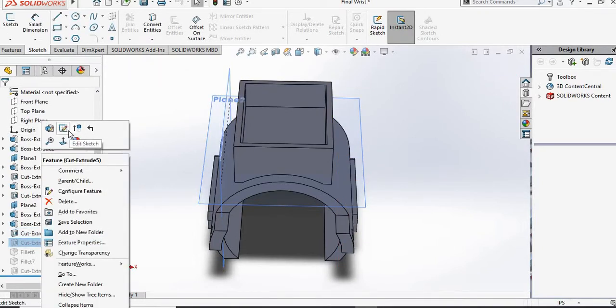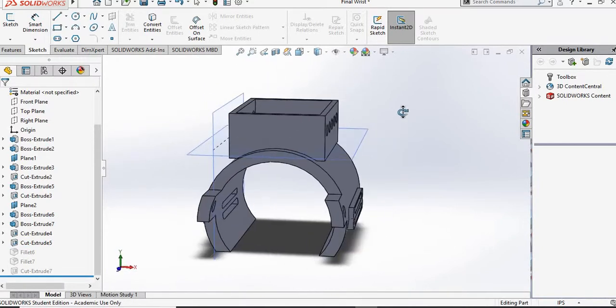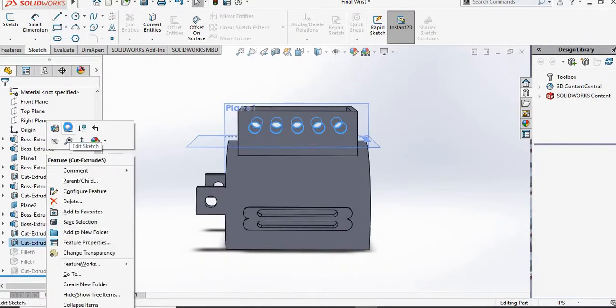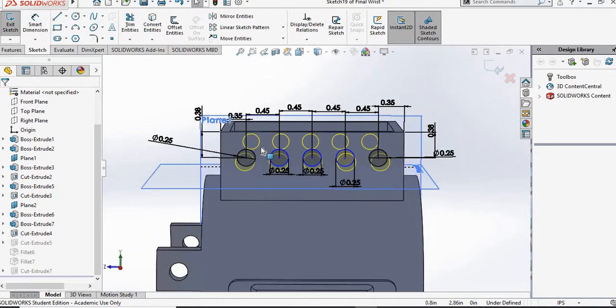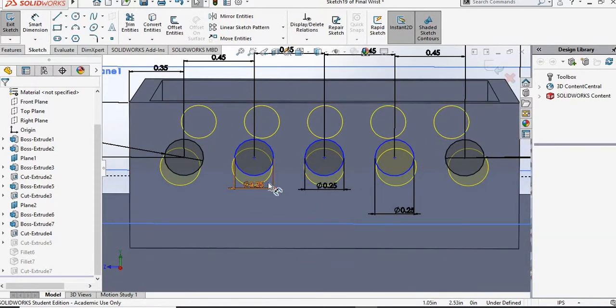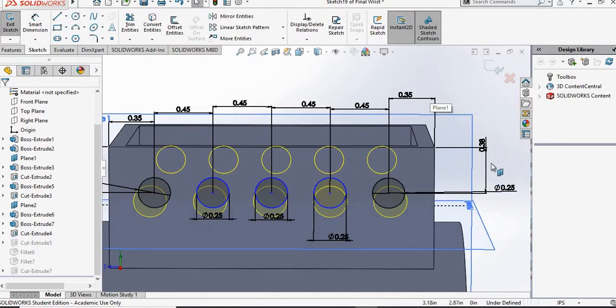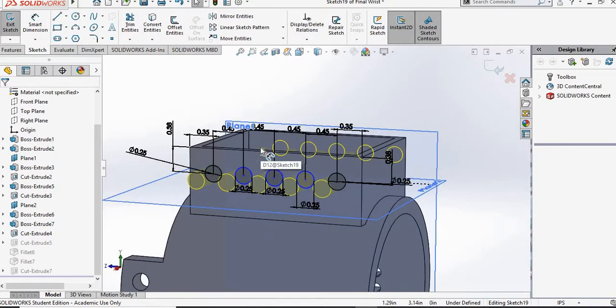After we made that cut and made our boxes, we went ahead and made more holes into this rectangular bracket, again with 1/4 inch diameter holes. We made 5 of them, 1 for each string, because this is our part where we will adjust the string tension. And again, here are the dimensions. So they're 1/4 inch holes with these dimensions apart from each other and apart from the edges. It's kind of hard to see, but hopefully you get the point.